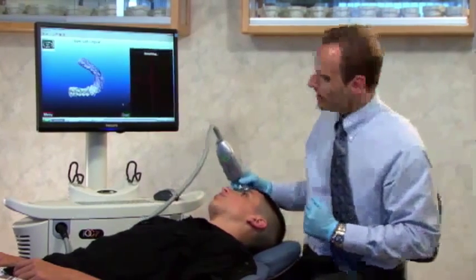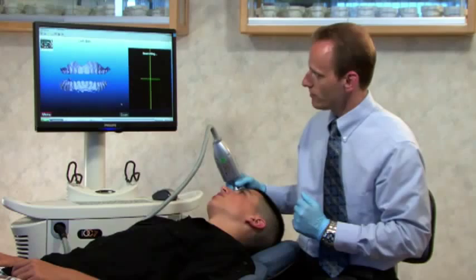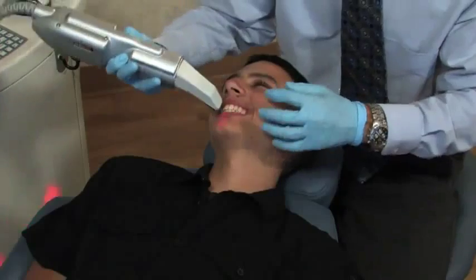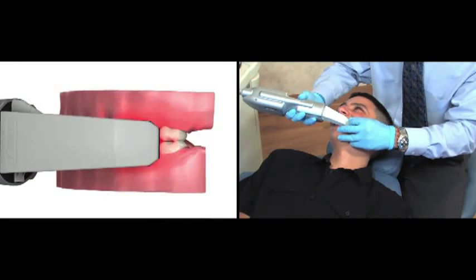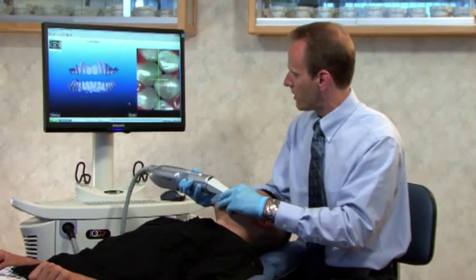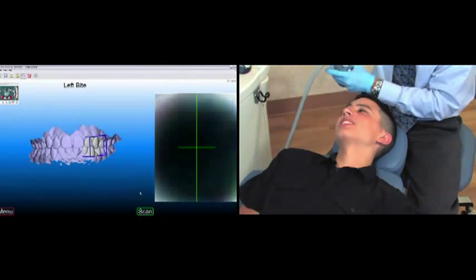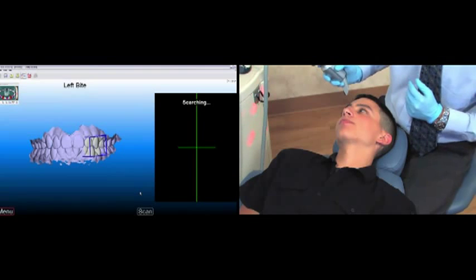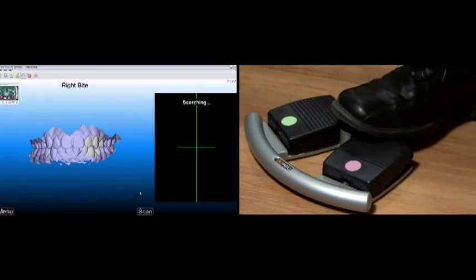Now we'll scan the bite — press the pink foot pedal, then press green, and the system will ask me to capture the bite from the left side. I can scan the bite from anywhere on the left side. I want the vertical line to follow the occlusal plane, or show an equal amount of the upper and lower, and I'll press the green foot pedal to capture the scan. The occlusion will come together. To confirm that occlusion, I'll press the pink foot pedal, then green, and scan the right side.